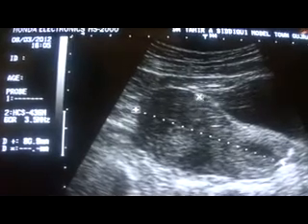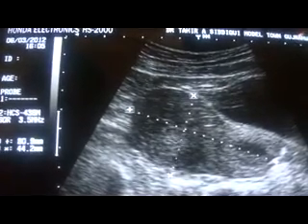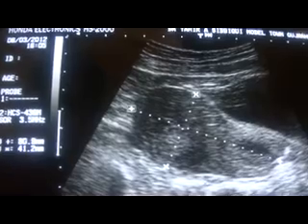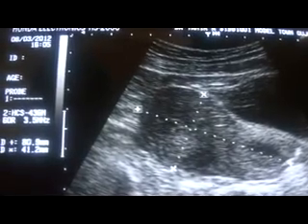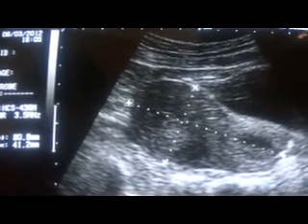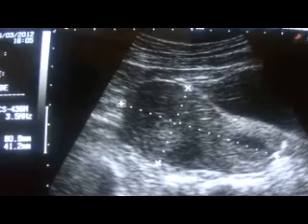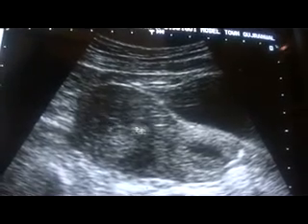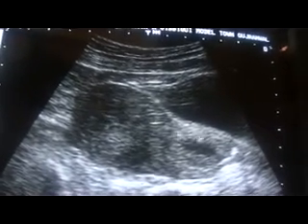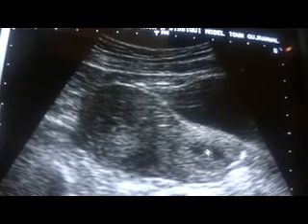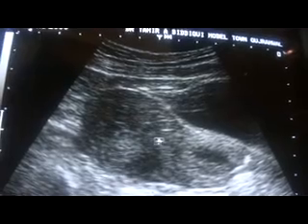Now you see two cystic areas. I am showing you two cystic areas — which is the urinary bladder and which is the pathology? I am in transverse section. Now I am in longitudinal section. You are seeing the uterus along with two cystic areas. Which is the pathology and which is the urinary bladder?